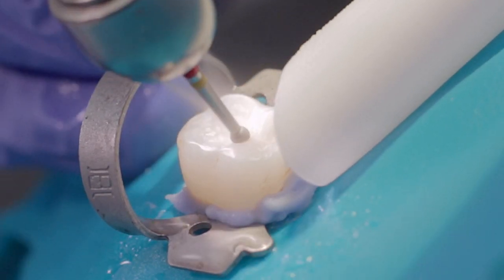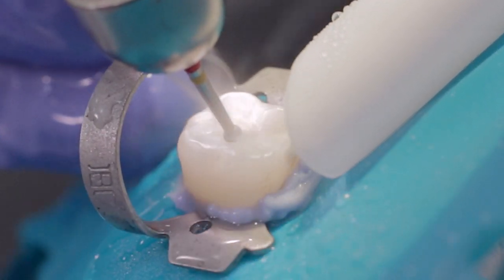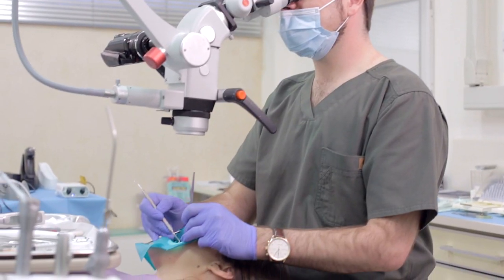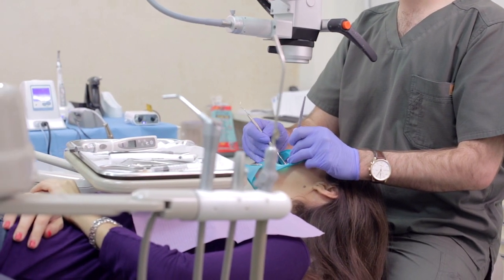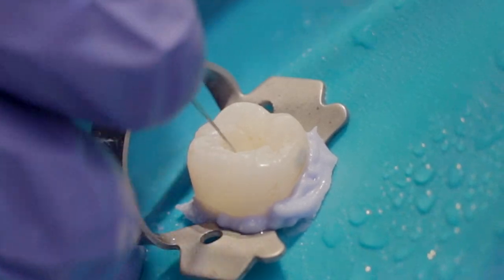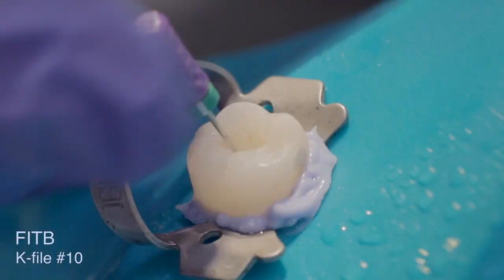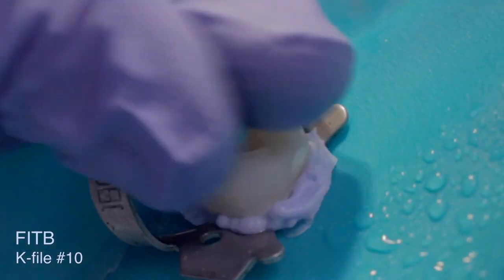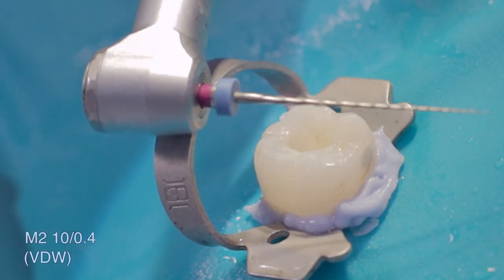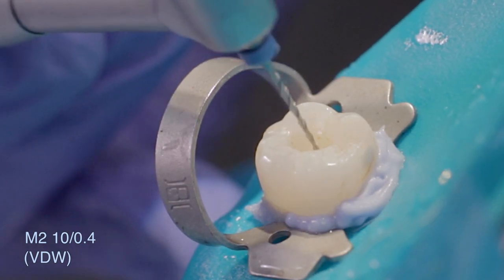Prepare a standard access cavity and determine your working length. Check for the first instrument to bind at working length. This canal was classified as a complex canal, and a NiTi Rotary File System was selected to prepare a tapered glide path. Information regarding additional glide path options can be found in the SAF System Clinical Guidelines Manual.